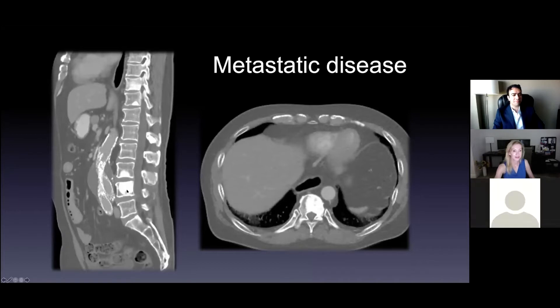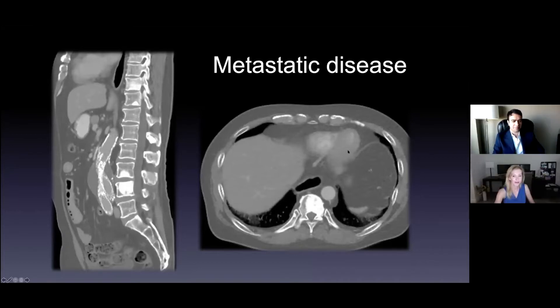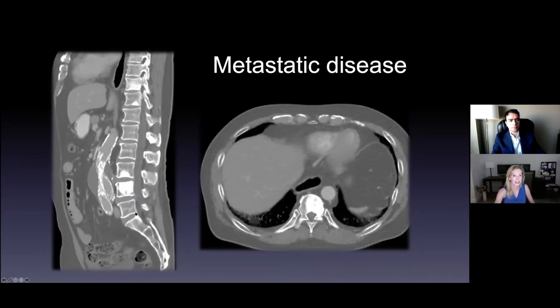Sagittal CAT scan, axial CAT scan. This was a body image — an abdomen scan, not a dedicated spine study. You can see in the spine, look how much wider this is, and this and this. Sclerotic metastases in a patient with prostate cancer. There are multiple here — in L4, L3, up here in the T-spine.